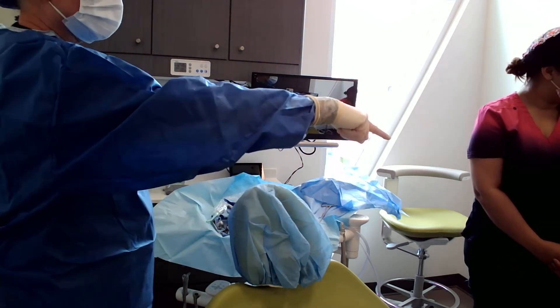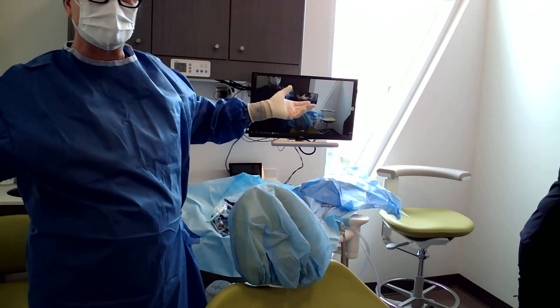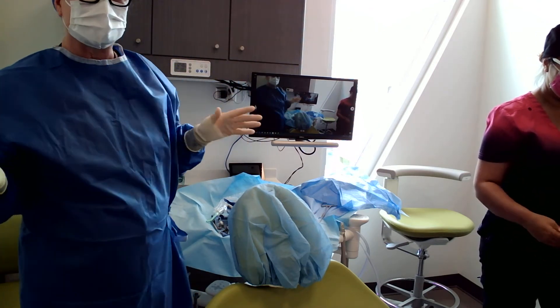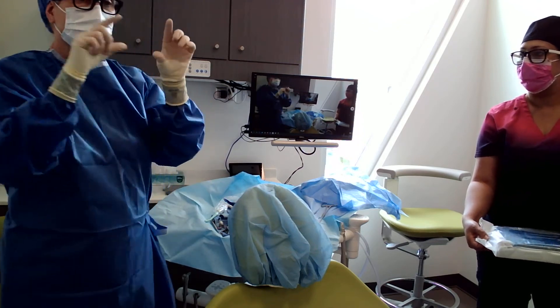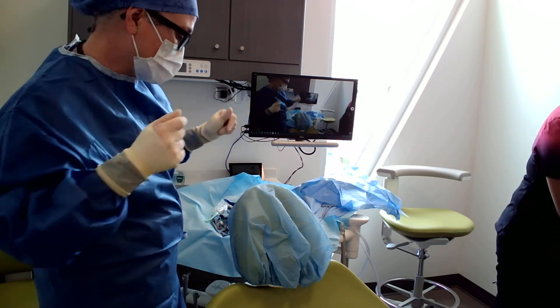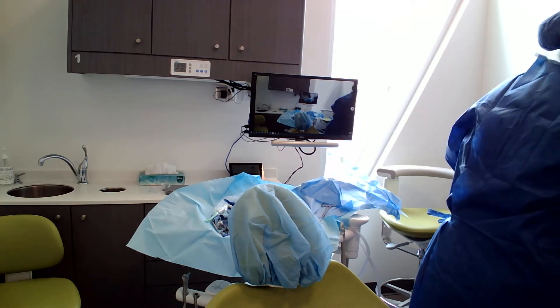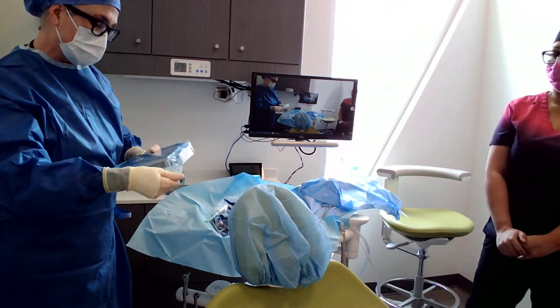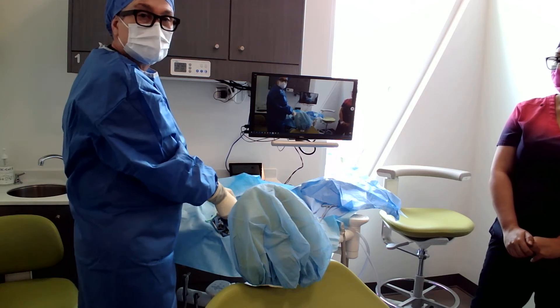Right behind Nina is the implant kit — it's double-bagged. Typically it would be double-wrapped, but I didn't have wrapping big enough. When we double-bag things, we want to be able to see the borders on all four sides. I also forgot to put in my sterile indicator — you always have to make sure those go into surgical kits. So I come over, grab this, and here's my implant kit. I can put it on the sterile area because this bag was inside the other bag.